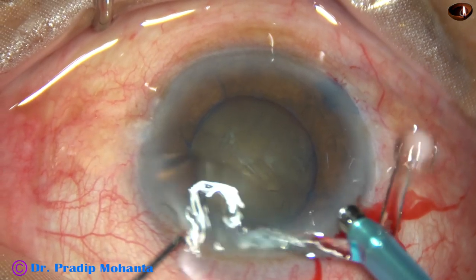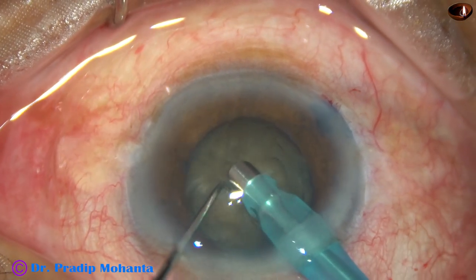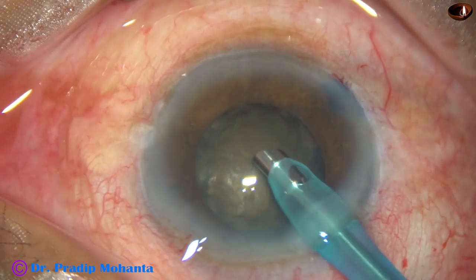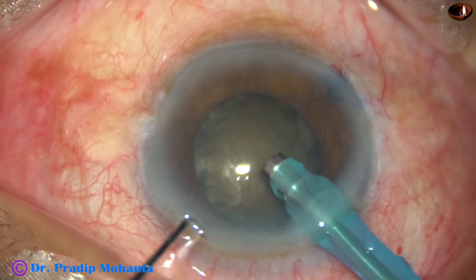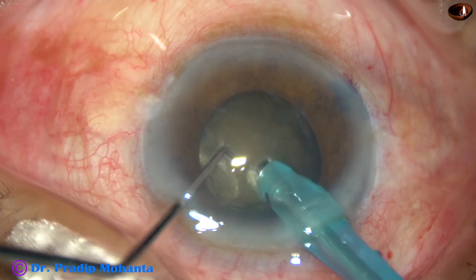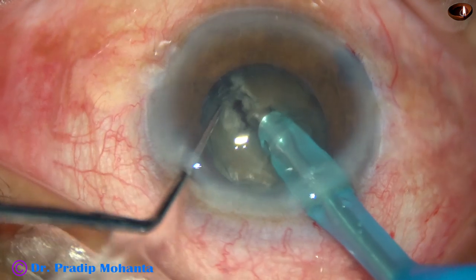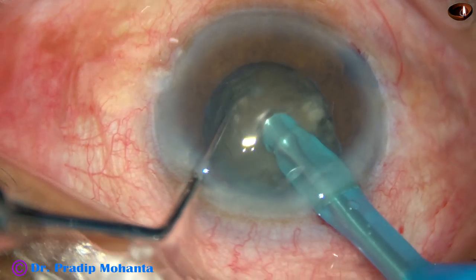Visco is injected and now I proceed with the phaco handpiece. The bevel is down towards the lens mass, and some superficial cortical lens matter is removed. Then with the help of the left hand, the handpiece is turned — the bevel is up now towards the corneal endothelium. Here is how I divide the nucleus: the tip is buried just in front of the main incision and it goes through the substance of the nucleus like a submarine. A crack happens along the track, and the chopper is used along that crack to divide the nucleus into pieces.